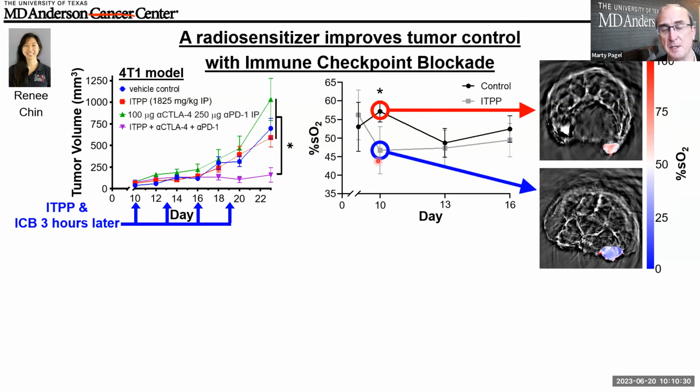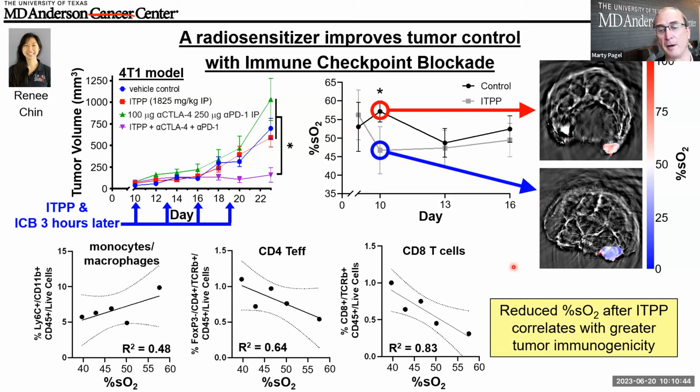You're deoxygenating the blood vessels, or deoxygenating your hemoglobin. And therefore, you can't really tell what's going on in the tumor itself in that microenvironment, but you can see that there is some change in the blood vessels that does correlate with the response to immunotherapy. So kind of an indirect method.